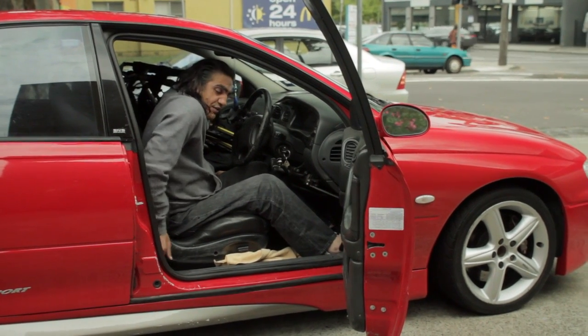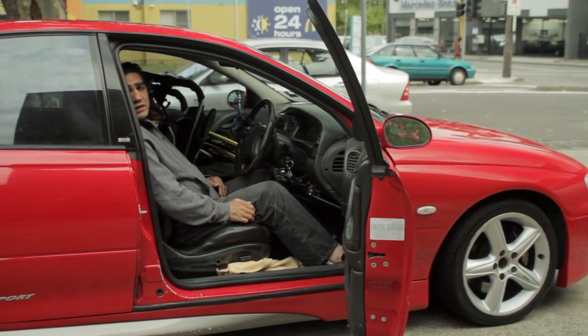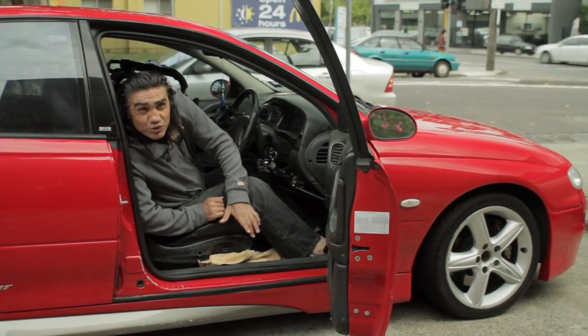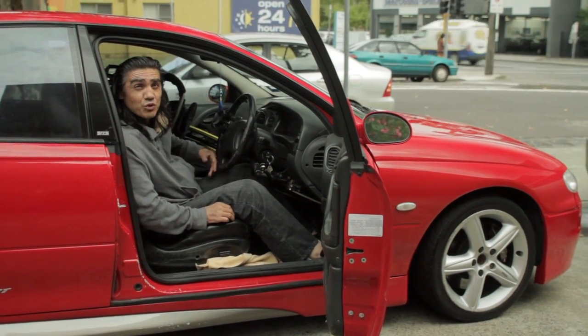And also when I have the seat lean back, I use this pillar as a balancing tool. I'll just put my body into it, and I know I'm not going to fall out, and I can reach out with both arms and do what I need to do.